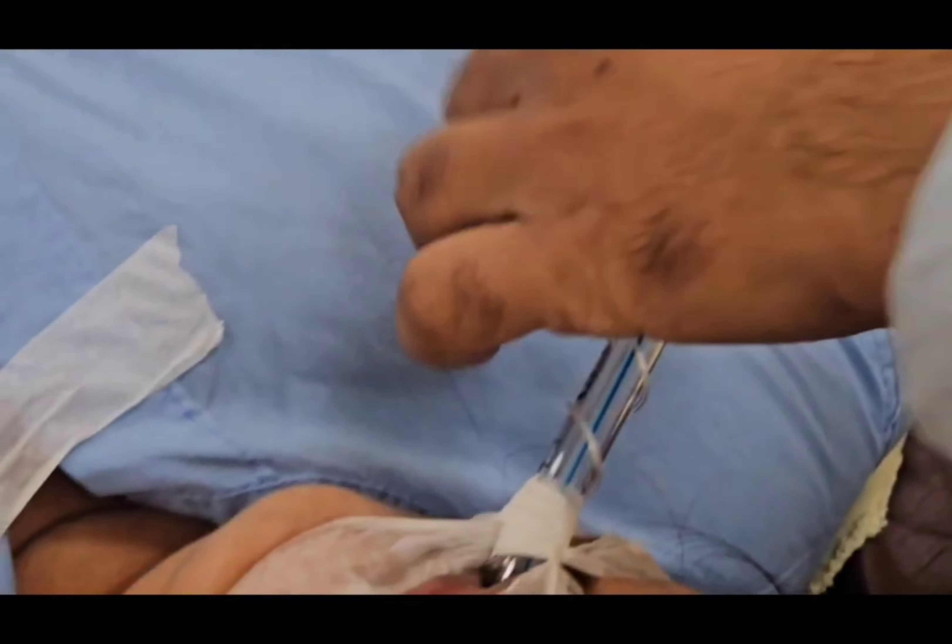We will now deflate the cuff. We are checking the monitor to see the vitals — the oxygen is still maintained. We are checking if the patient can respond. The patient can already open her eyes. We will now gradually withdraw the endotracheal tube, ensuring suction once again to remove any residual secretions, and gradually the tube is withdrawn.